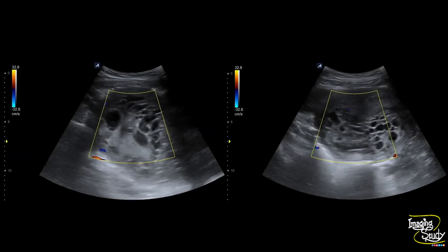Here are the color Doppler pictures. No aberrant vascular flow is seen. As there is no severe vascular flow, it will also be helpful for the clinician to evacuate without massive bleeding.